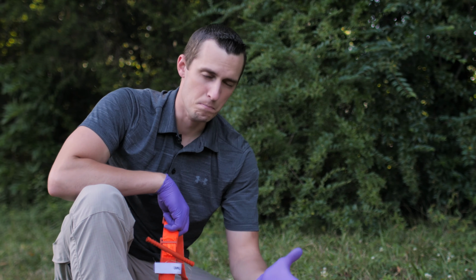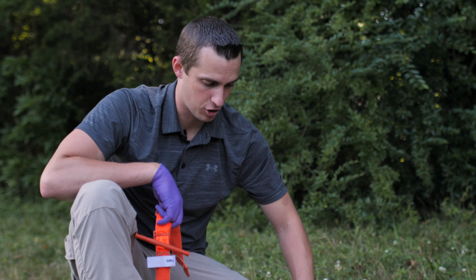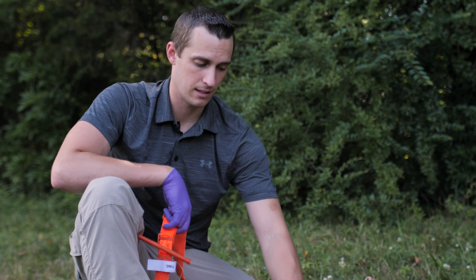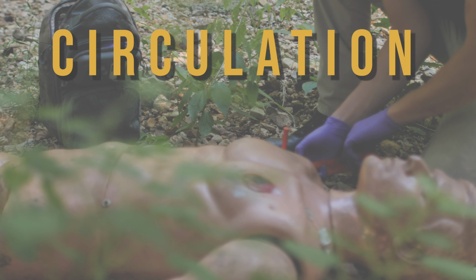So now we have moved or relocated that tourniquet down to 2 to 3 inches so we have good perfusion again in the upper part of this arm. So while we were here in the C portion of the MARCH algorithm, the TCCC guidelines say that now if we have a tourniquet applied that we applied in the M for the MARCH in massive hemorrhage, we can now convert that tourniquet over to wound packing with a pressure bandage if certain criteria are met.